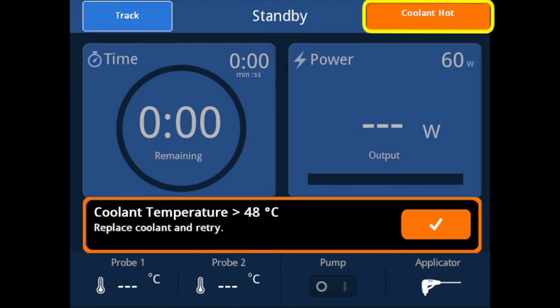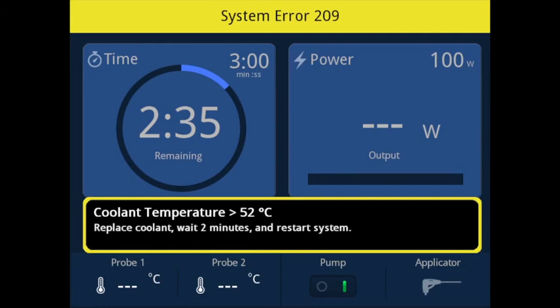The coolant hot warning will be displayed when the applicator temperature sensor detects the coolant to be hotter than 48 degrees Celsius. If an ablation is in process, the system will abort and return to standby mode. The warning must be acknowledged by pressing the checkmark button and replacing the coolant source before the ablation can be restarted. The coolant fault will be displayed when the coolant temperature exceeds 52 degrees Celsius. If an ablation is in process, the system will abort and enter the system error state. Replace the coolant, wait two minutes to allow the tissue to cool, and then restart the system. If the error immediately recurs, it may be necessary to reposition the tip into cooler tissue or replace the applicator completely.